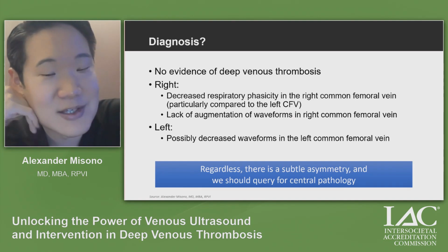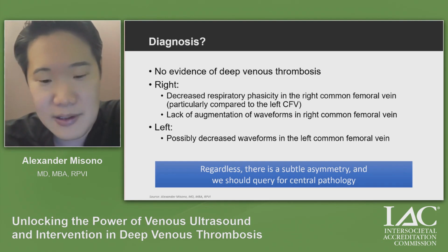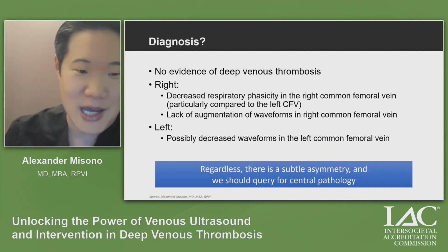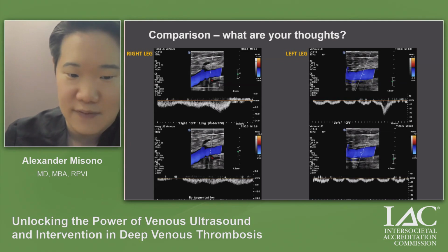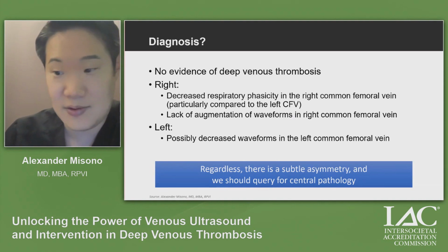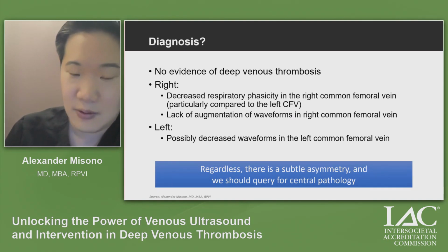Now, I may not convince you that those findings are individually true because it is so subtle, but do you agree with me that there is in fact a subtle asymmetry? And I go back and drive right back through, but isn't there a subtle asymmetry in the sides here, right versus left? So even something of this form, right? You don't have to just have flat waveforms to say, oh my gosh, there's something going on. If you see flattened waveforms, well, you better say there's something going on.